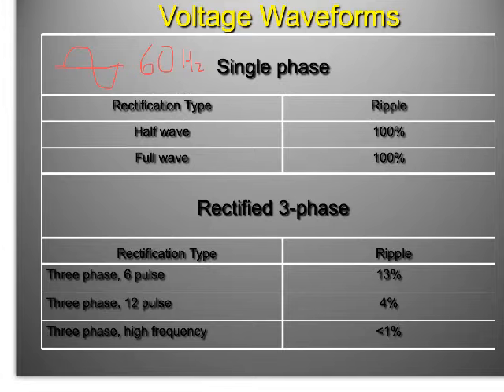There's a couple of different ways we could do that. One of the first ways we have is self-rectification or half-wave rectification. And that is this first step right here. Half wave would look like this. It would just be bump, and then there'd be a little space, and then bump. Because I wasn't able to get this part down here. I wasn't able to flip it over the line, right? I was only able to correct half of the cycle, right?